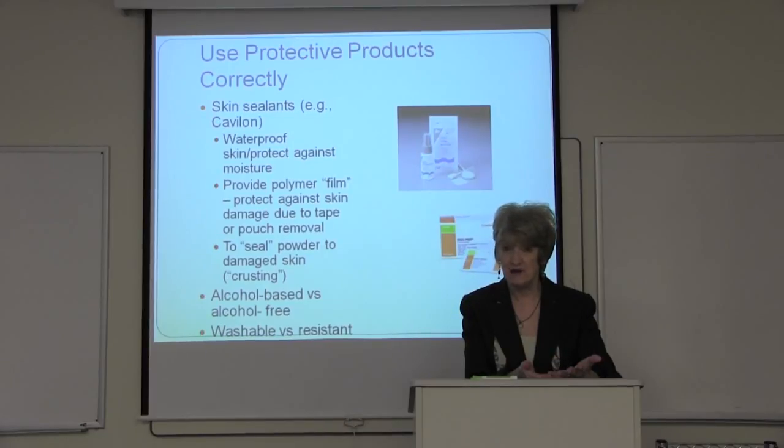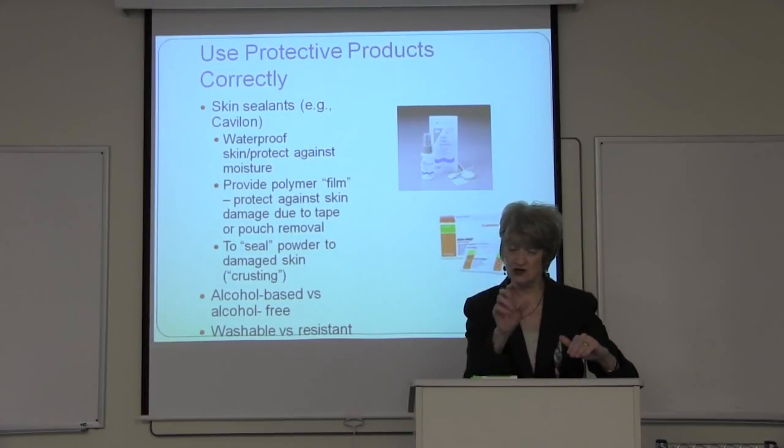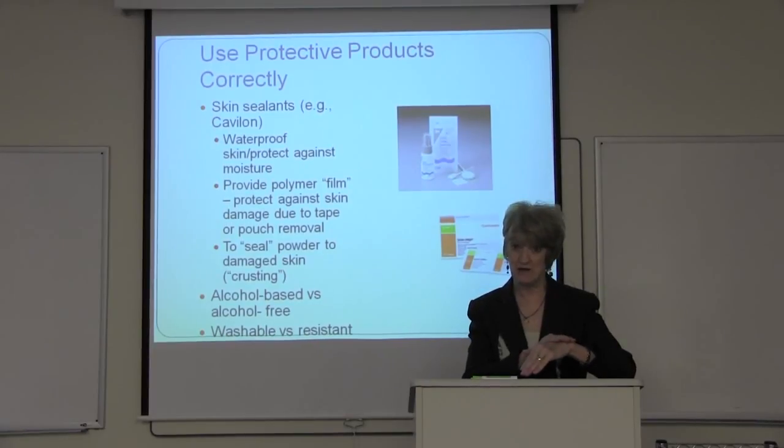The perfect example is if you have perianal skin breakdown, and maybe you're sprinkling on your ostomy powder and you're spraying or you're blotting with your plasticizing film, and you know that patient's going to have additional incontinent episodes and you know somebody's going to be cleaning them up.